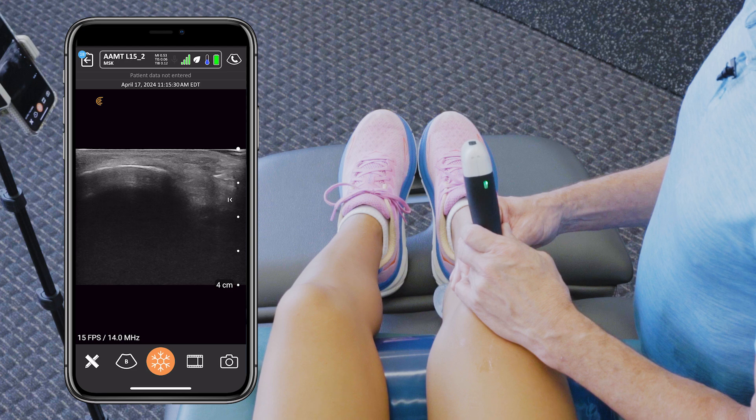Then we'll pull that needle out. And that is the ultrasound guided procedure for the patella tendon with the help and guidance of the Clarius linear probe.